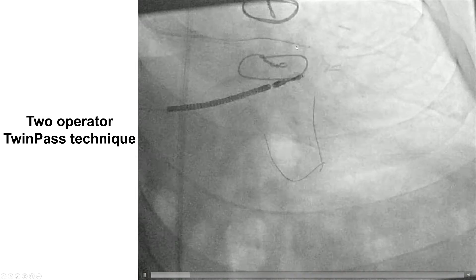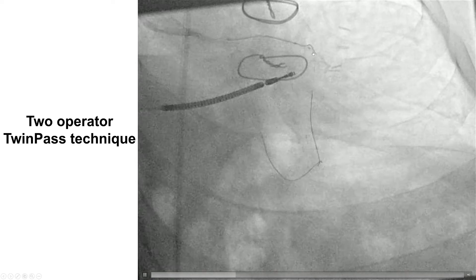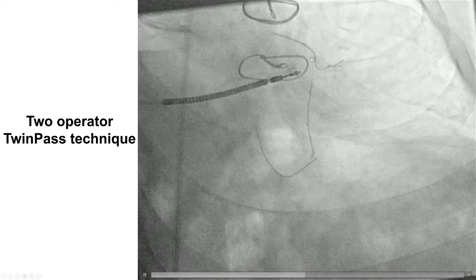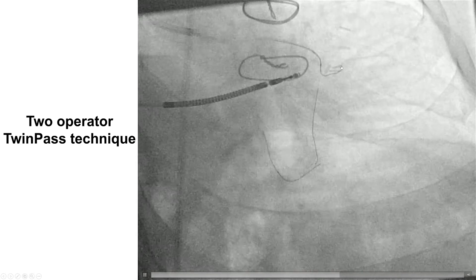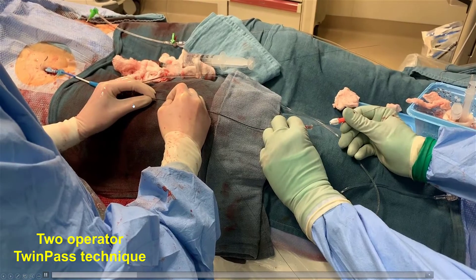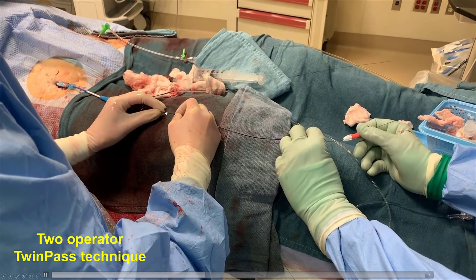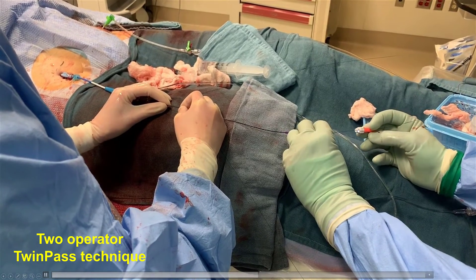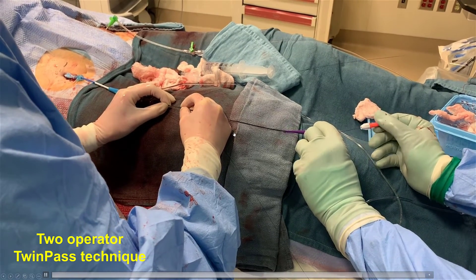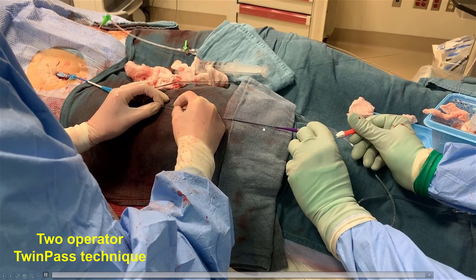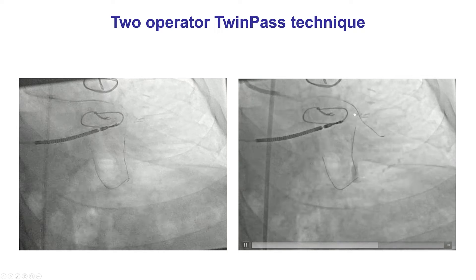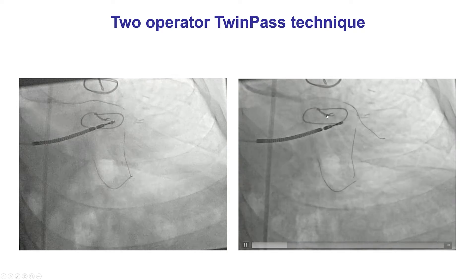That's exactly what we did — we used the dual-lumen microcatheter and tried to advance a guide wire into the distal portion of the RAMUS branch, but the wire kept going down the vein graft. Eventually it did find its way using the so-called two-operator Twin-Pass technique, where the first operator moves the dual-lumen microcatheter back and forth while the second operator probes with a soft workhorse guide wire until it finds its way into the main vessel. We were then able to advance the guide wire into the RAMUS branch, as confirmed by left main injection.